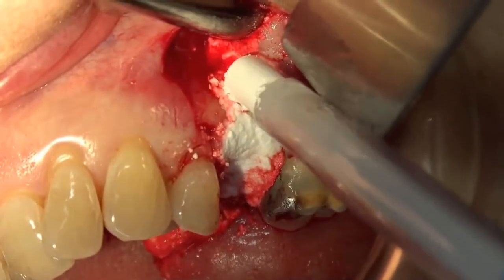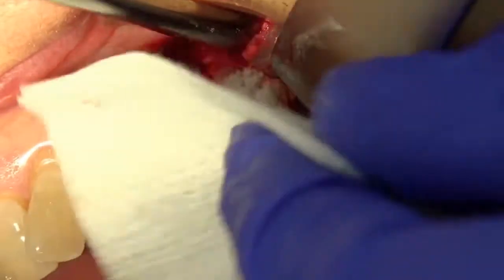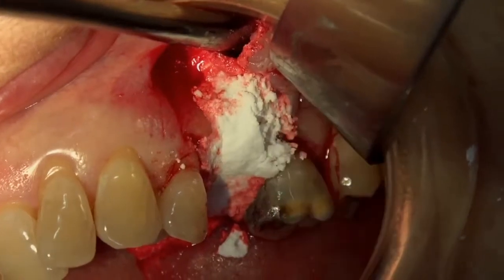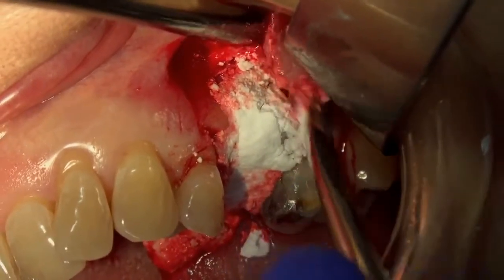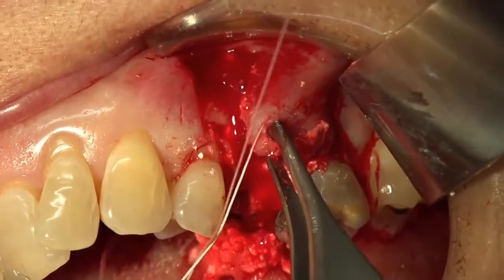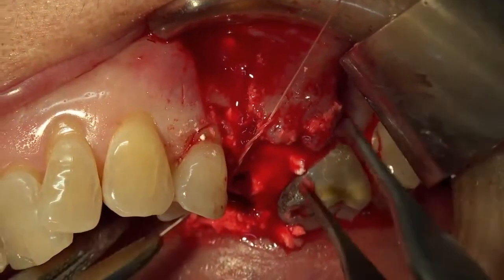And we can slightly overfill, press again for 3 seconds. Here we did it a few times because the bone deficiency was quite narrow, so we wanted to compact the material within the entire defect. Now we can remove some excess, and as you can see, we stretch the soft tissue with absolutely no fear.